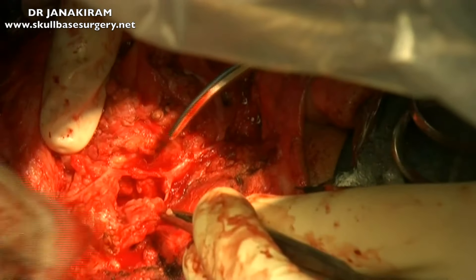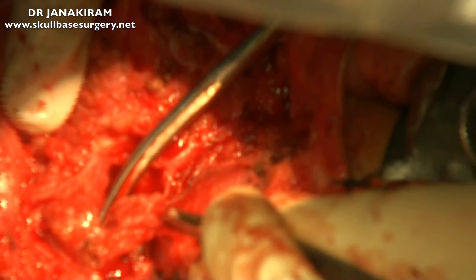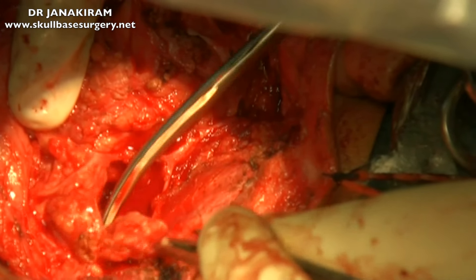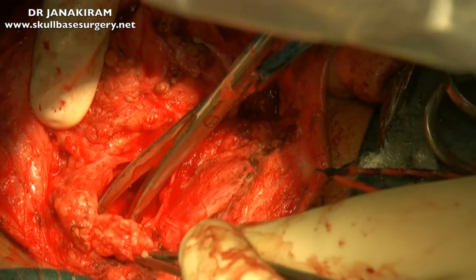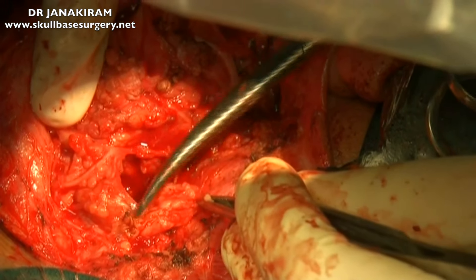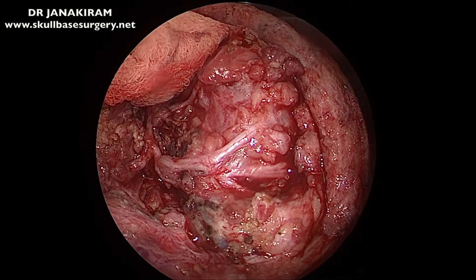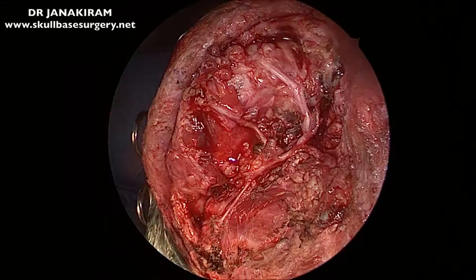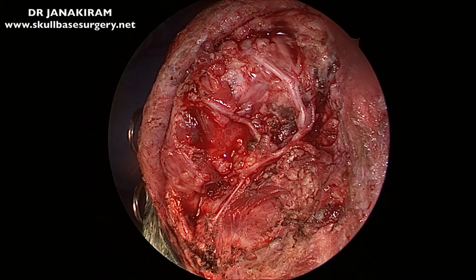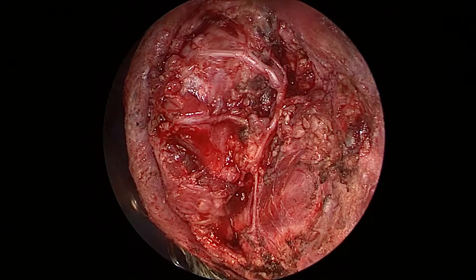Once we did that, we had to do a total parotidectomy, and that is mandatory for inflammatory lesions. So we are going between the branches of the facial nerve to remove all the pieces of the gland. Once we do that, here is the endoscopic final appearance — you can see the branches there. This is the final view — a fantastic view of the two divisions. Thank you very much for watching this video.